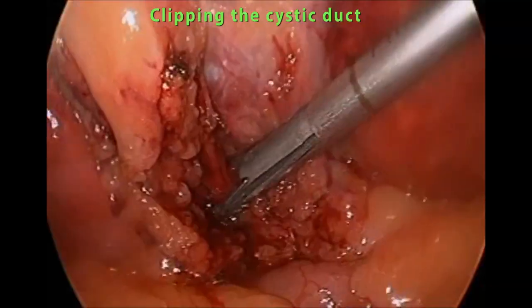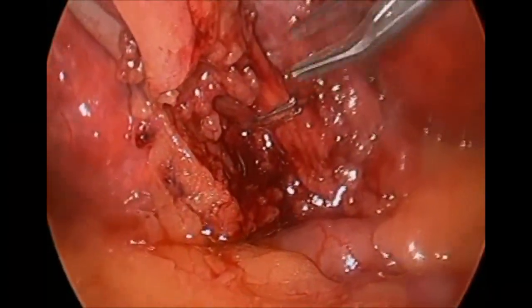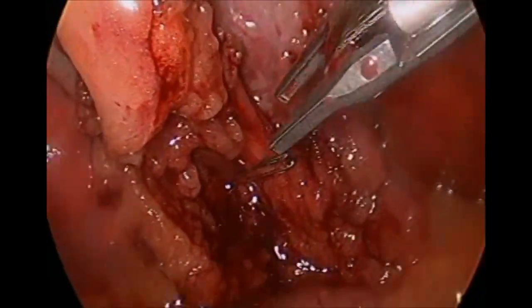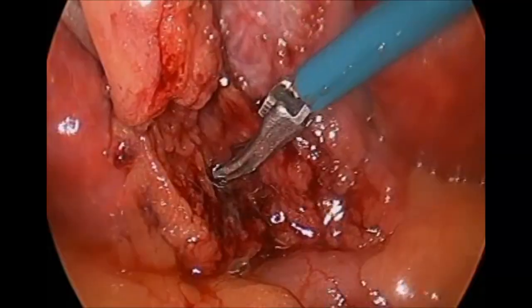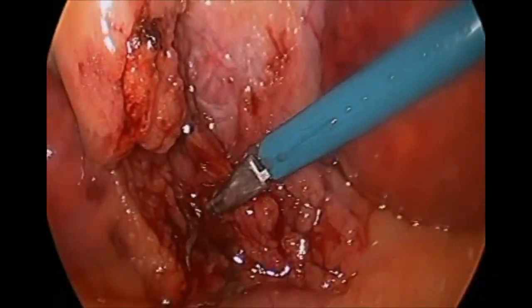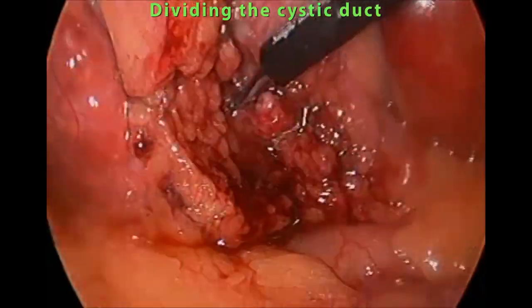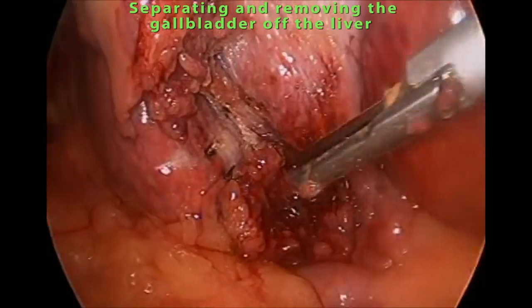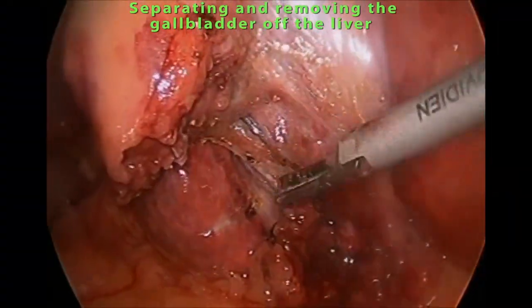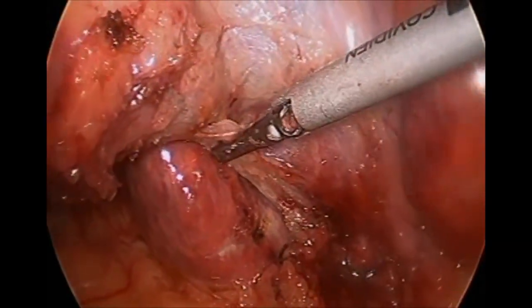Now we are clipping the cystic duct with two clips on the patient side, one clip on the specimen side. Now we're going to clamp down those clips so they don't come off. Now we're going to divide the cystic duct. Then we proceed with separating and removing the gallbladder off of the liver.